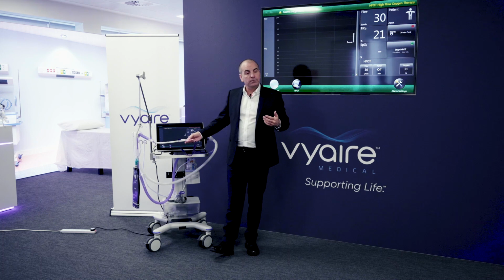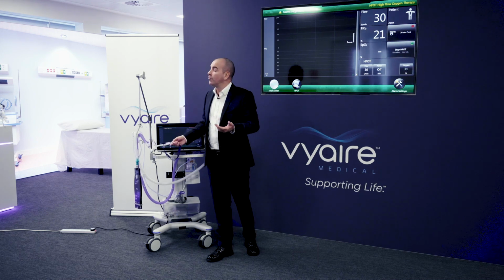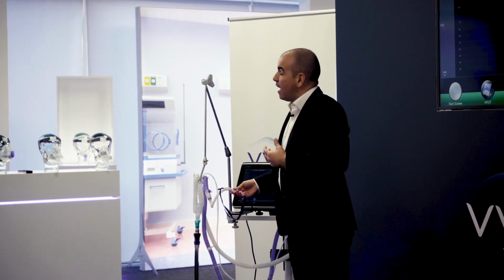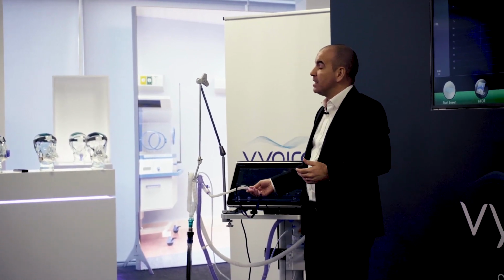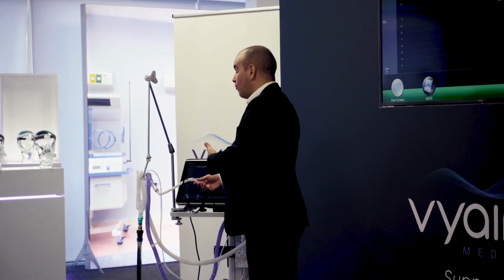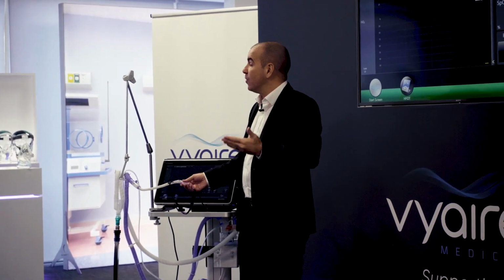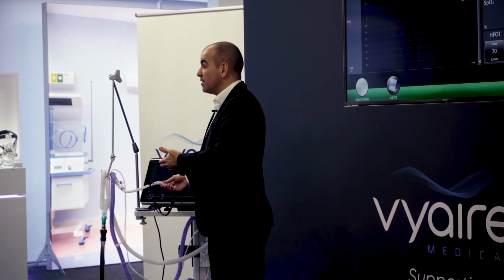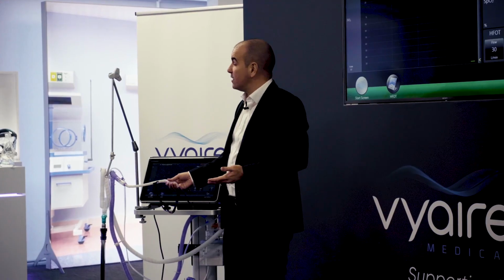Cost is certainly at the forefront of our customers' minds now. So they want to do more with less. Every capital device that they have in the department needs to be serviced every year. Their staff have to be trained on it every year. So you have one device that can do invasive, non-invasive, or high flow oxygen therapy. One device, one circuit. So there's a potential for cost savings there.